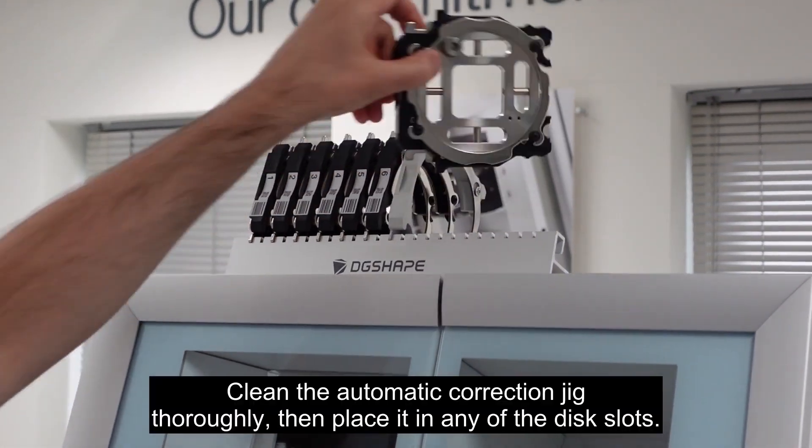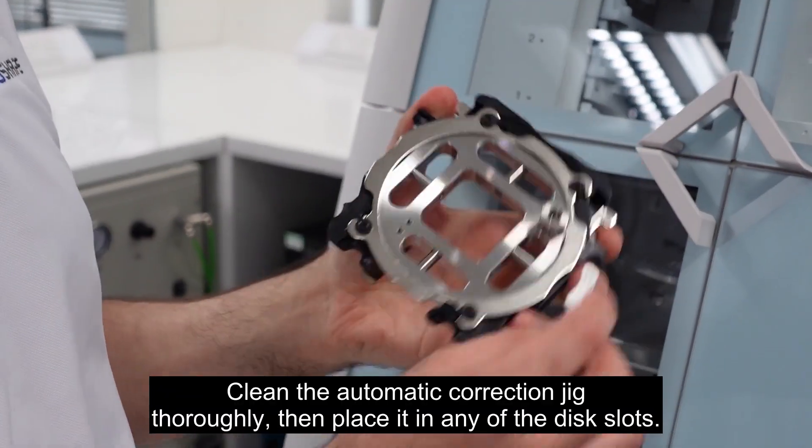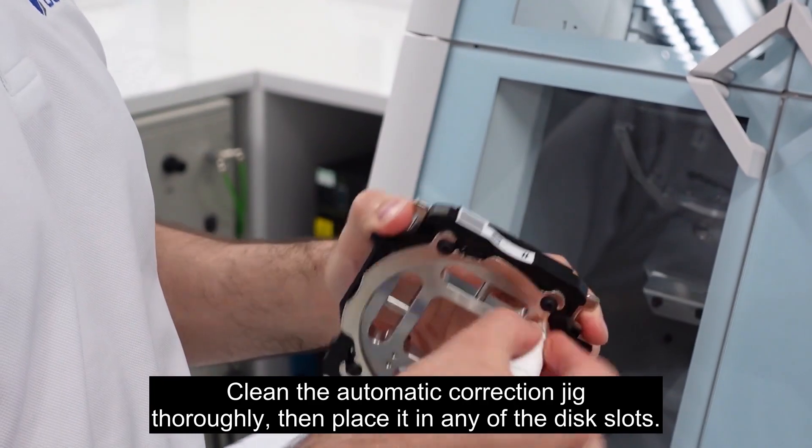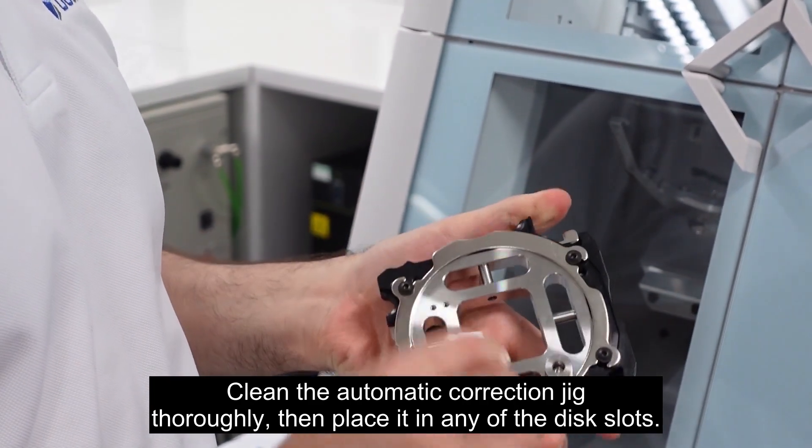Clean the automatic correction jig thoroughly. Then place it in any of the disc slots.